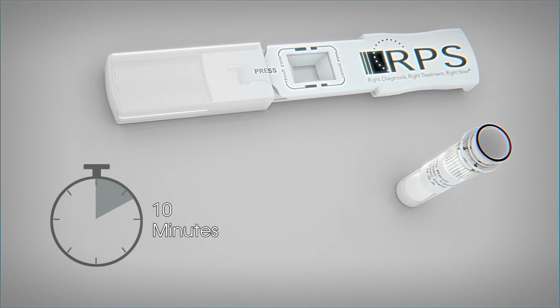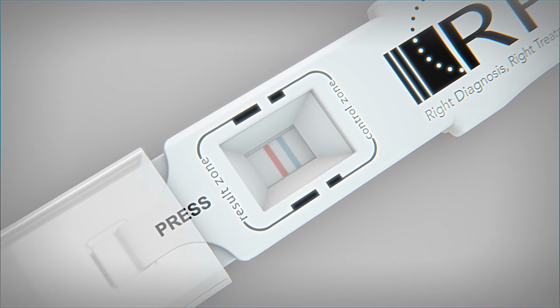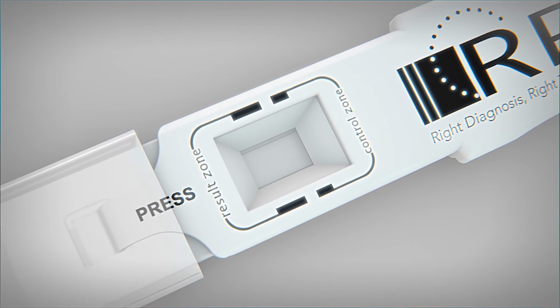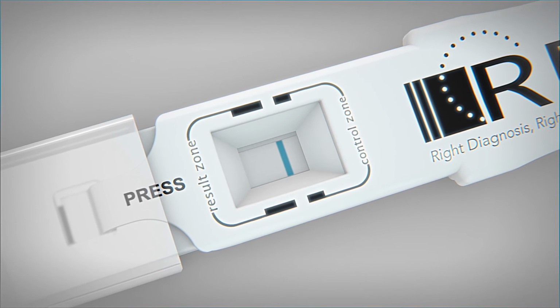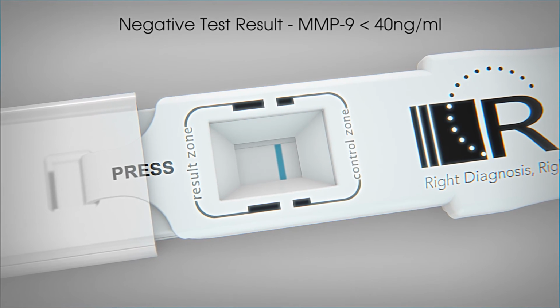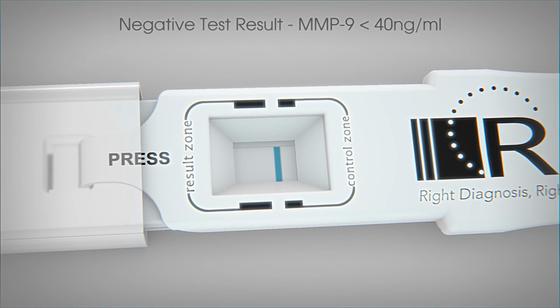After 10 minutes have elapsed, the test results may be read. The results of the test are indicated through 2 lines, which appear in the result window: the control line and the result line. The control line appears as a blue line in the control zone and must appear for the test to be valid. The presence of only a blue line in the result window indicates a negative result. If the test is negative after 10 minutes, allow an additional 5 to 10 minutes of running time prior to interpretation.